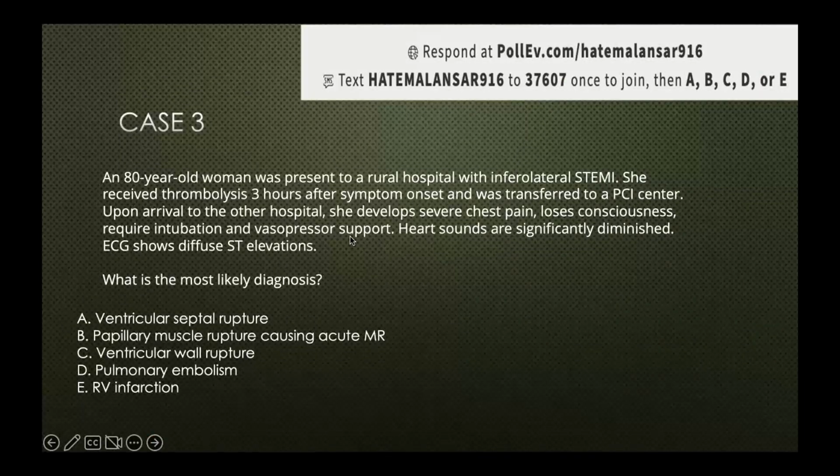So here you can see the third case. I'll just give you a few minutes to read it and give me answers, if you don't mind.